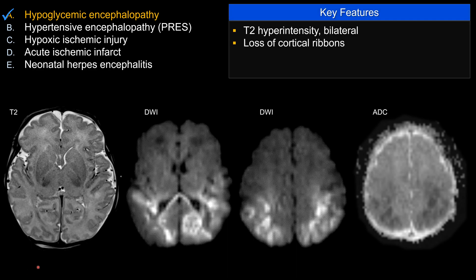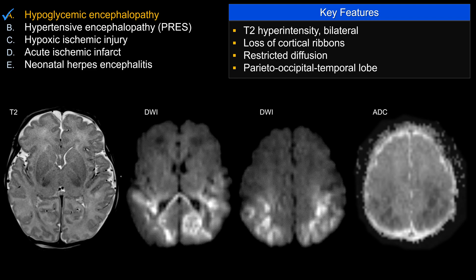On T2 weighted sequence, you can see there's abnormal hyperintensity associated with the posterior parietal lobe, posterior temporal lobe, and occipital lobe. There's a loss of cortical ribbon. Compare that to the very sharp, nicely defined cortical ribbon anteriorly. On diffusion, you can see clearly restricted diffusion involving the same area — the posterior aspect of the temporal lobe, occipital lobe, as well as parietal lobe. So this is a good pattern for hypoglycemic encephalopathy.